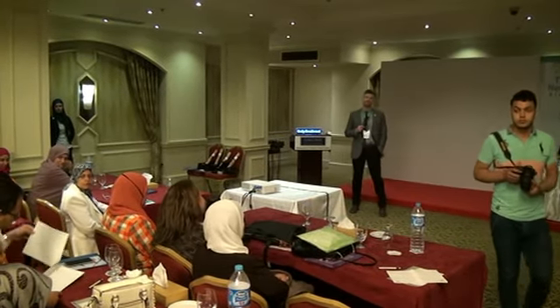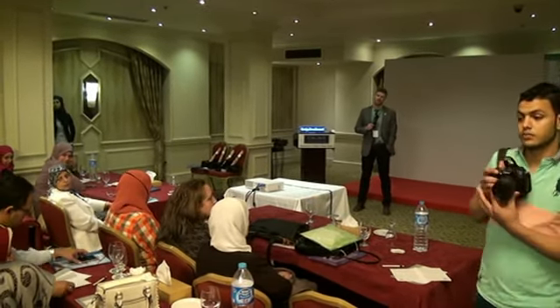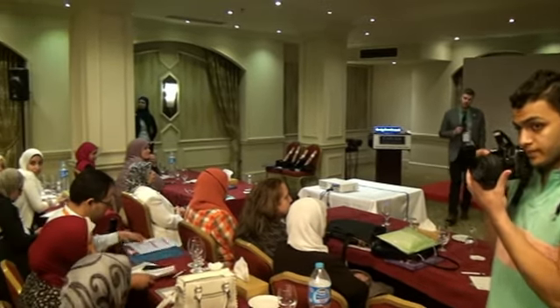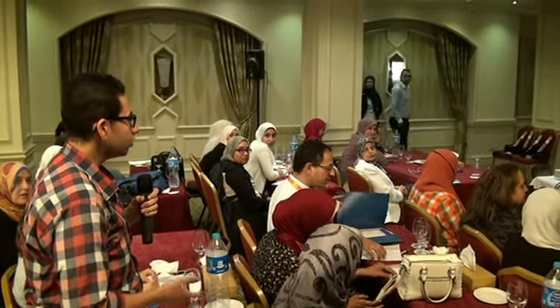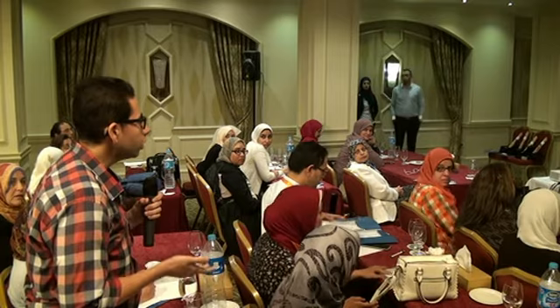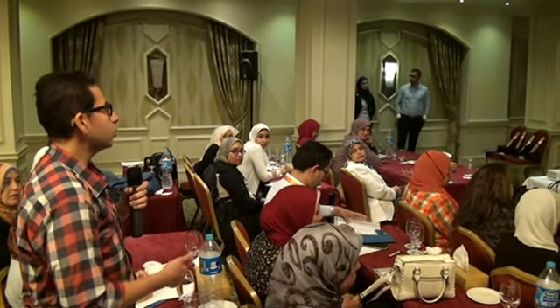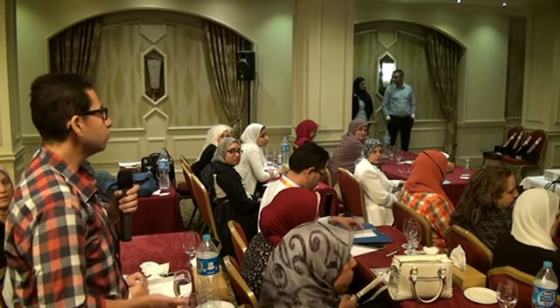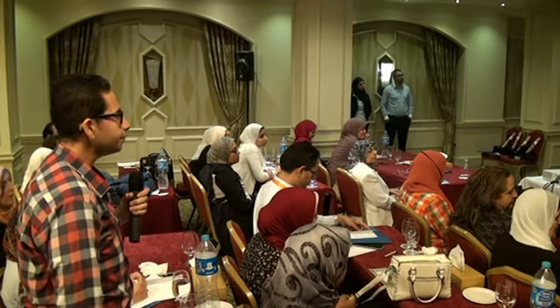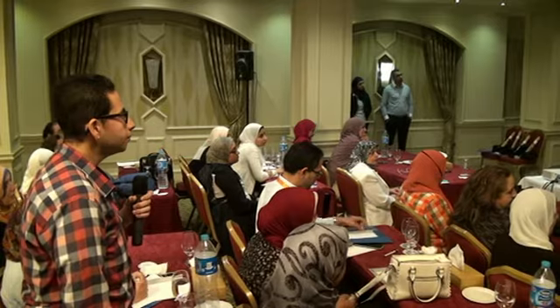Concerning the capnograph, you said that if the baseline doesn't return to zero, that means CO2 rebreathing, and that means CO2 in dead space. Yep. Actually, I think there's always CO2 in dead space unless the baby's on a ventilator and inspiring 100% oxygen, or did I get it wrong? You shouldn't have CO2 in the dead space.